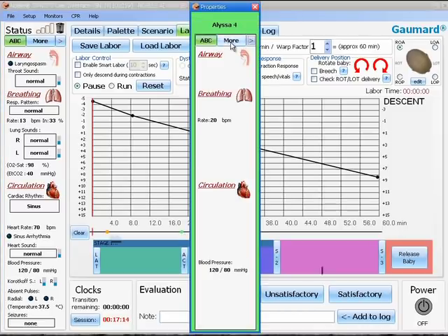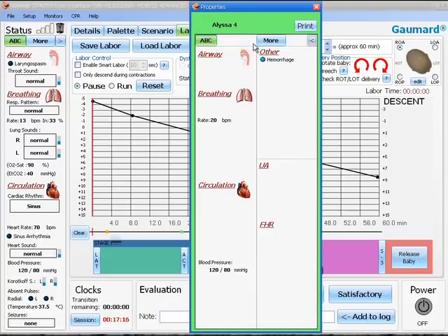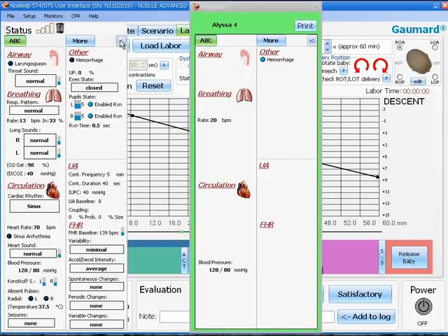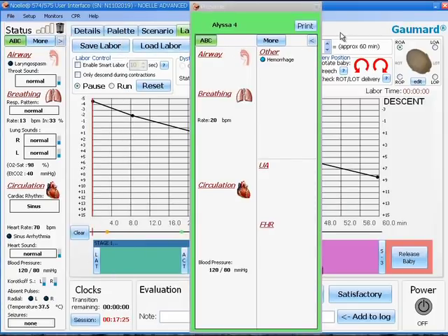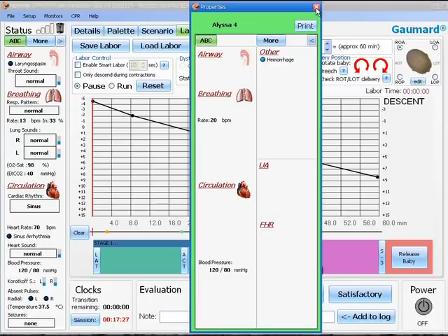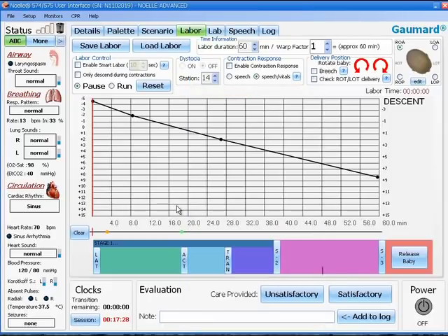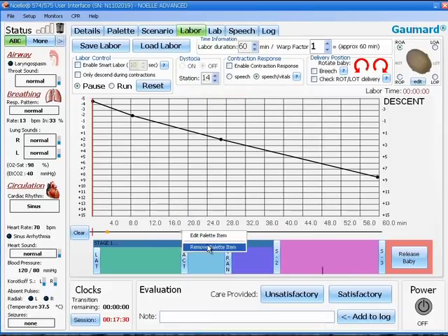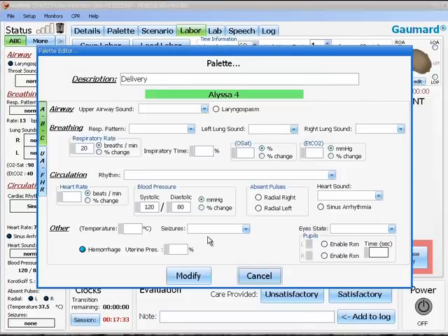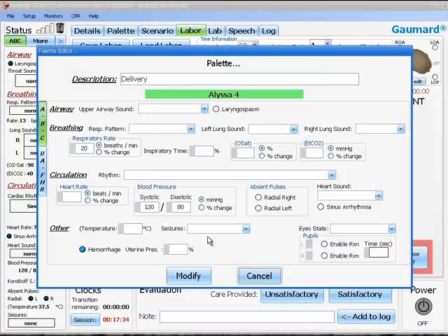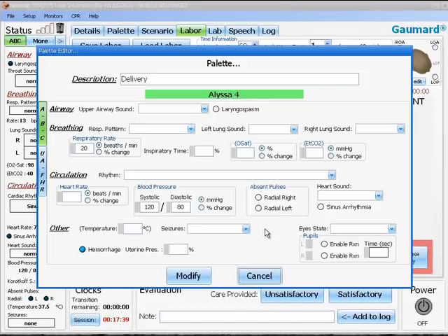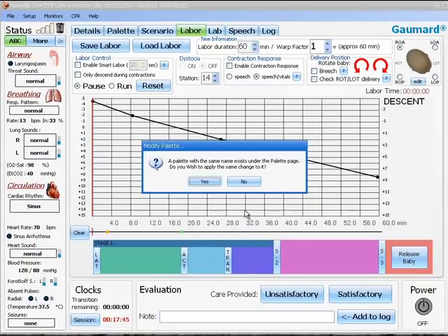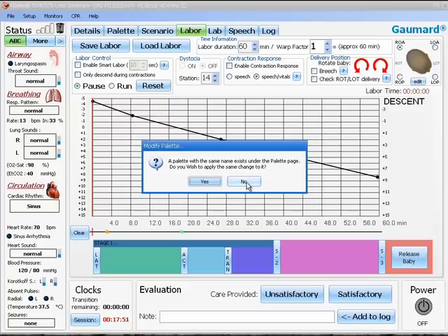If you double click the palette, a window will appear that shows you the properties of that palette. It will look much like the status window. Also, if you right click, you can remove the palette item or choose to edit the palette. If you choose to edit the palette, a new window will appear. After you have edited your palette, you will be asked whether you wish to change the palette in the palette window or just for this particular scenario.